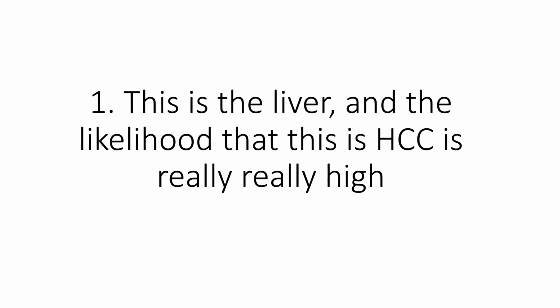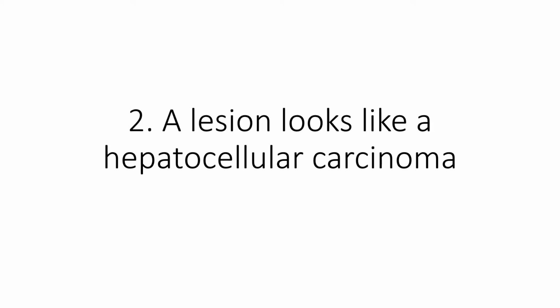So IHC is helpful in two circumstances. One, when you have a biopsy from a mass lesion in the liver, and obviously, given that HCC is the most common primary malignancy in the liver, and HCC, regardless of what your clinician tells you, is going to be pretty high on the differential diagnosis. The second situation where you'll be thinking of a hepatocellular carcinoma, and this applies both to hepatic lesions and non-hepatic lesions, is when you look down the microscope and the cells look like a hepatocellular carcinoma.